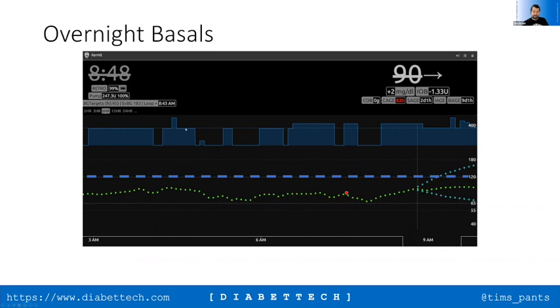And we can see the insulin's being turned on and off, and quite frequently it seems to be giving a bit more than basal, but then again it's been dropping out. But the key thing here is that the IOB in the overnight period has resulted in waking up with an IOB that's 1.3 units lower than the expected IOB would be using basals alone. And that's a key indicator that there's something not quite right with what's going on here.